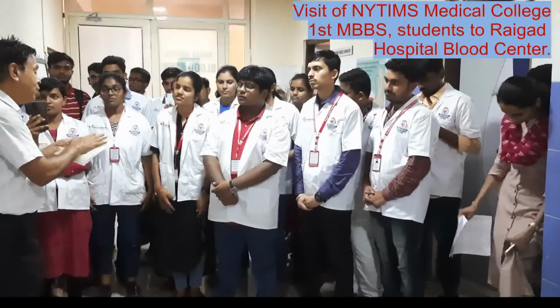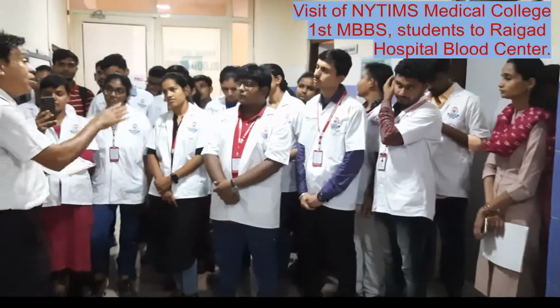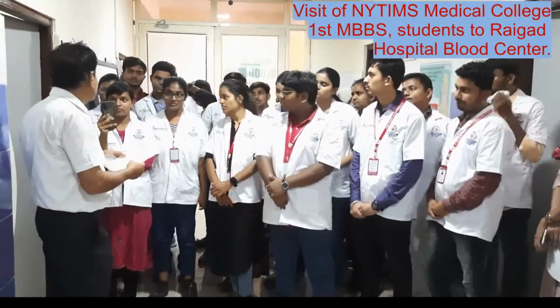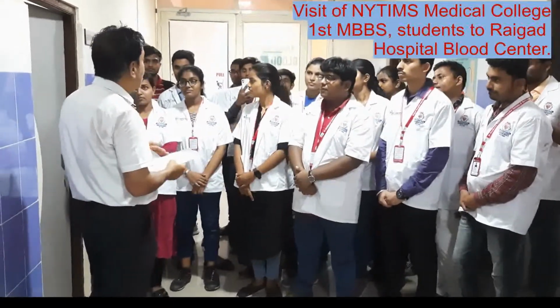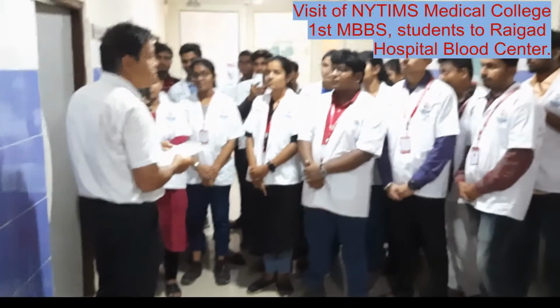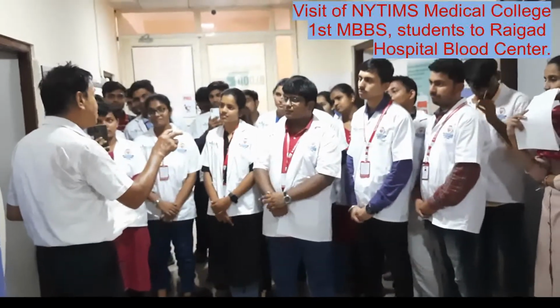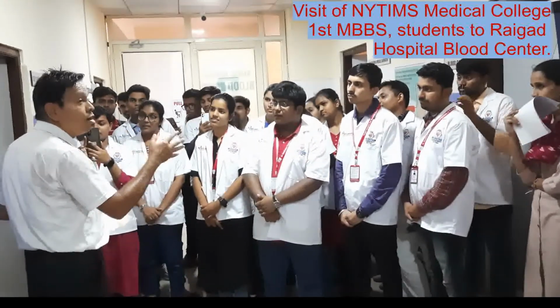In blood group we are doing the ABO and Rh group. This is only 2 group systems. There are so many systems, 33 systems. Huh? 13. 30. Yeah, good. Now, in the medical field, every 7 months, no, not even 7 months, every 73 days, the knowledge is becoming double.